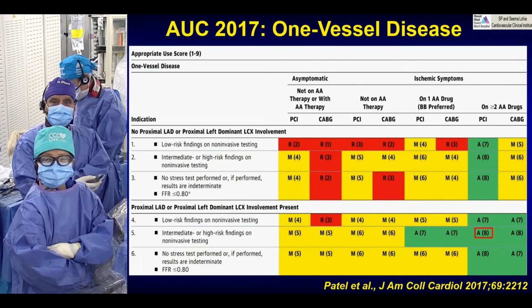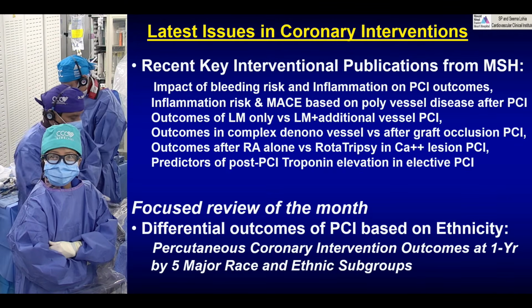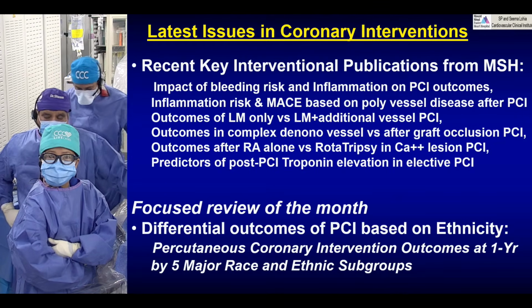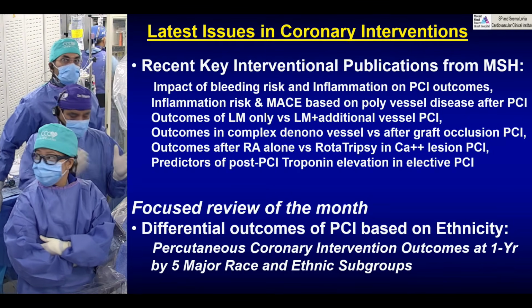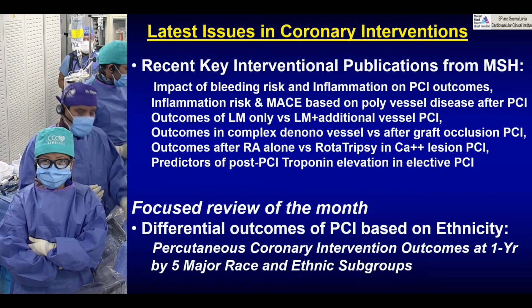In this particular case, we started with the drug-coated balloon, but this is what happens. All the drug-coated balloon trials have shown that anywhere from 5% to 25% of the time, you will not be able to do a drug-coated balloon, even if your strategy was that way, because in a case like ours with dissection, you are going to put a stent.